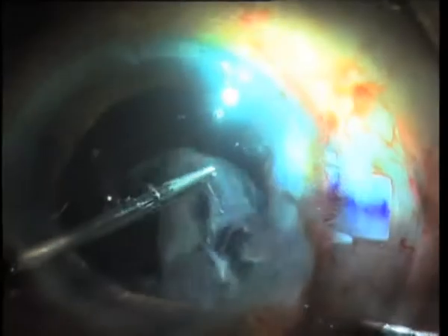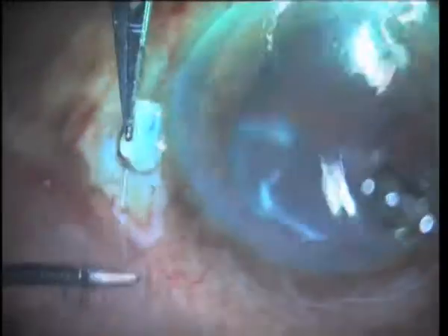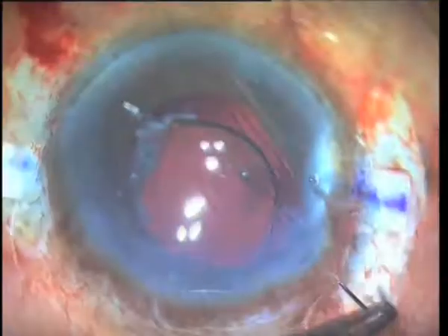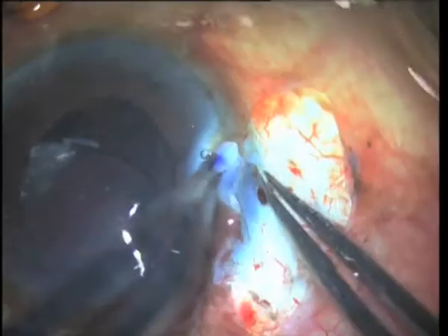This time, the IOL is carefully manoeuvred and both haptics are externalised with the aid of the handshake technique. The section is sutured and the haptics are tucked into the scleral tunnels.